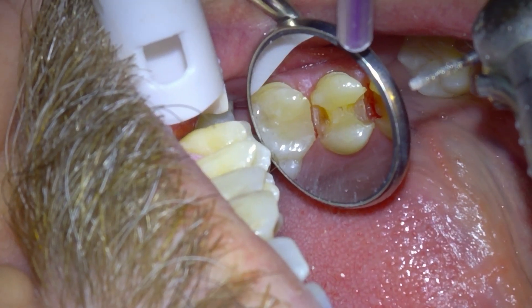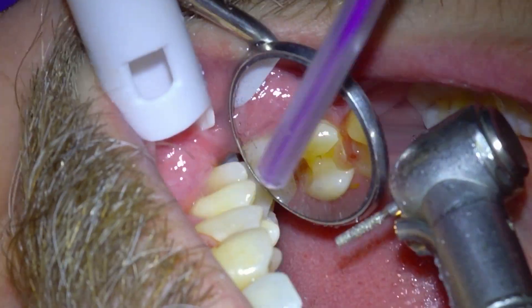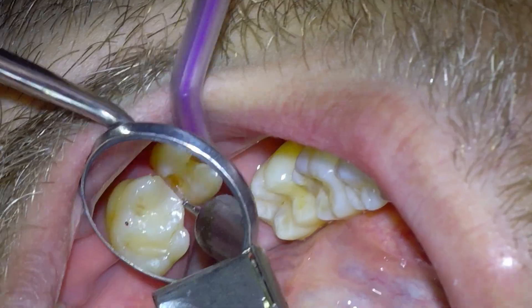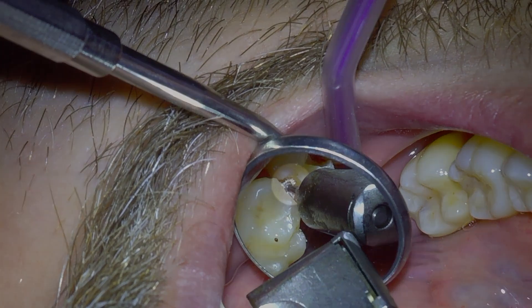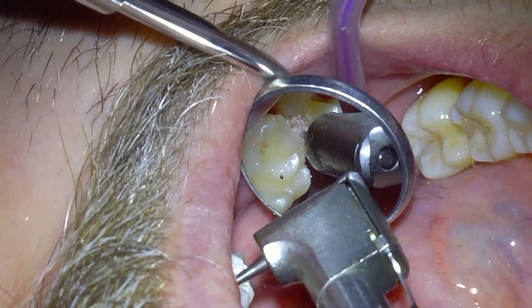After a lot of drilling, you can see there's a slight discoloration left behind, which is still some remaining decay. So we remove the remaining decay again with the slow speed drill. This time, instead of complete mush, we get a kind of flaky, half-mush half-solid texture — you see this when you are almost done removing all the decay, and that's one way I know we're almost done.